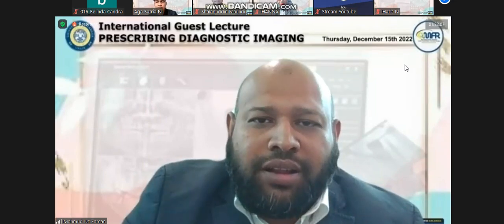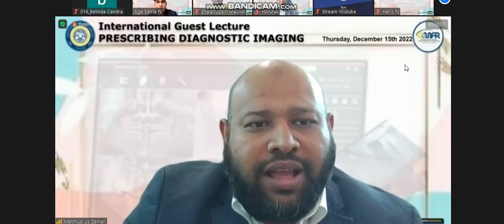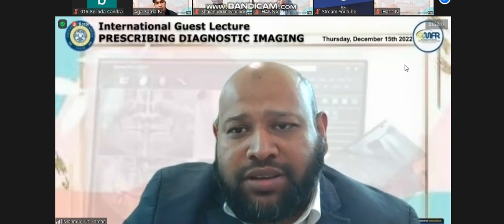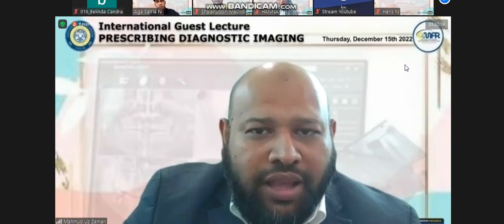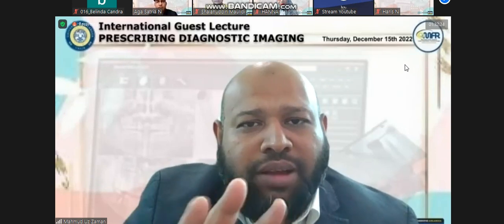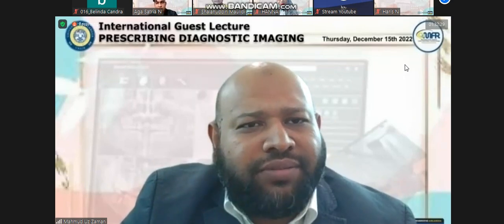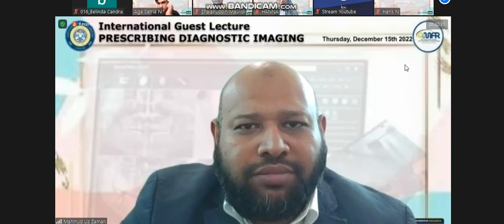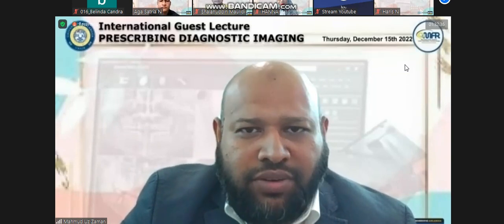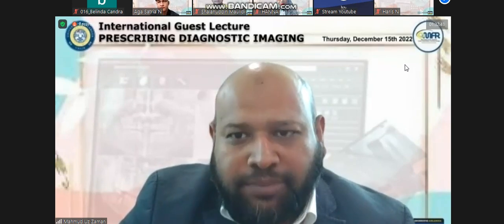But children are very difficult to handle. If there is any movement of the patient during CT or CBCT, your image will be blurred, so you will not get the necessary information. For periapical radiographs, if you need to take the whole jaw, you can take it for the patient. It would not be harmful for the patient.